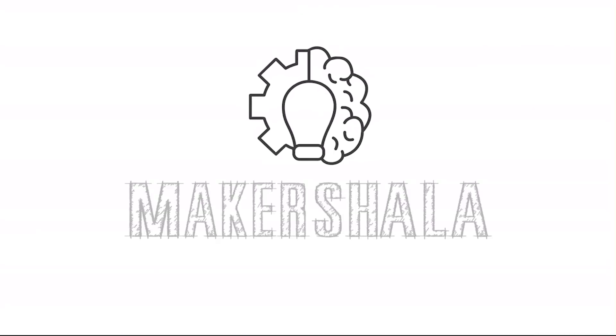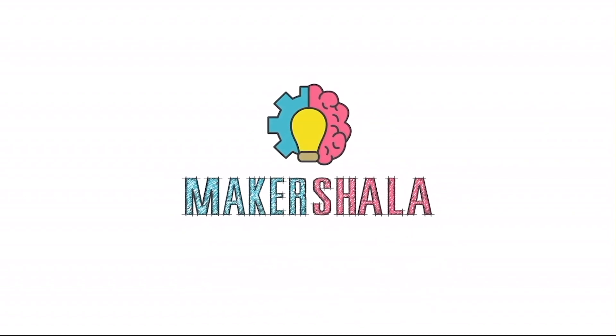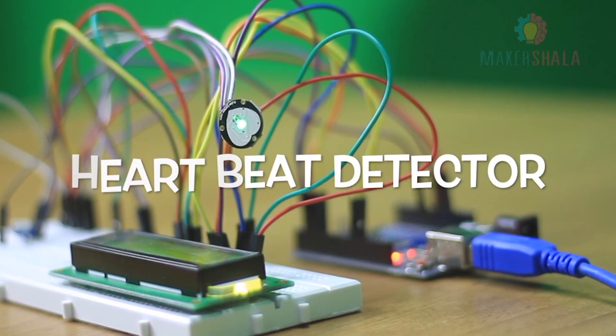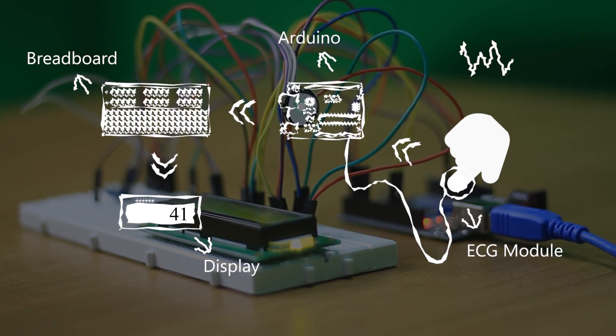Regular monitoring of blood pressure aids in early identification of impending cardiac disease and breathing problems. But how do we detect heart rate? In this experiment, we will build a circuit which will detect our heart rate by recognizing our blood flow as soon as we place our index finger on the sensor.